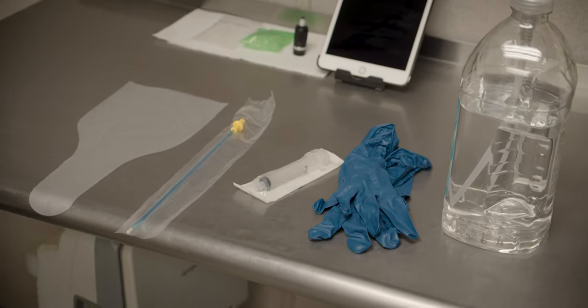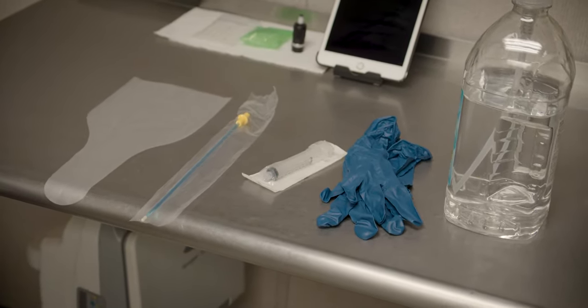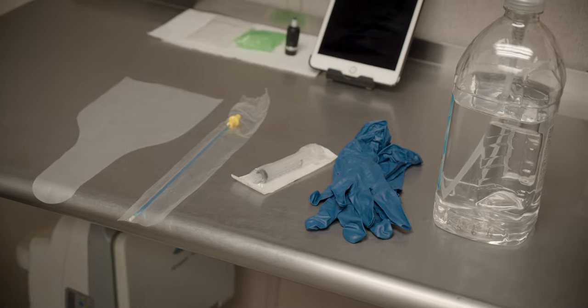The supplies that you will need to have are a semen collection bag, a 6ml or larger syringe, a flexible pipette, gloves, and non-spermicidal lube.